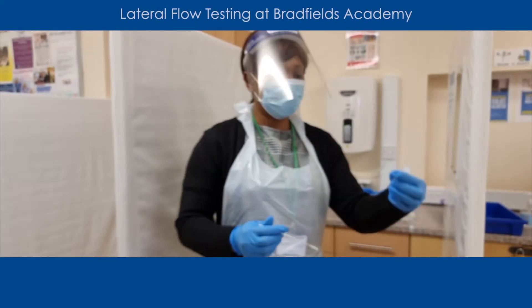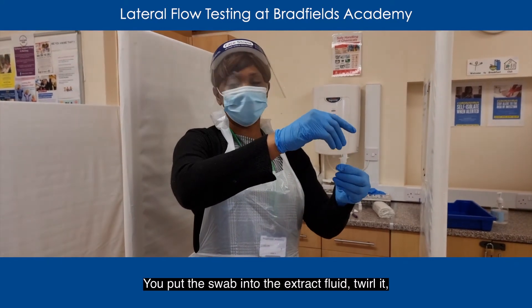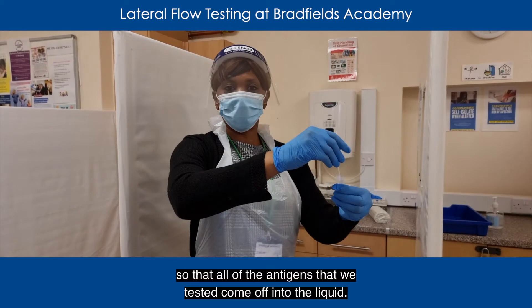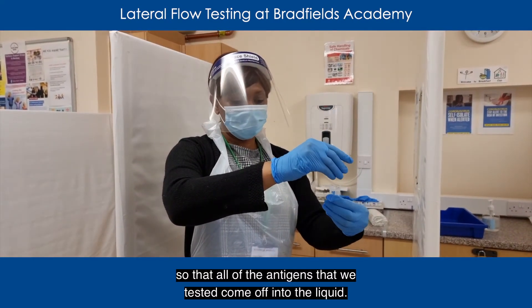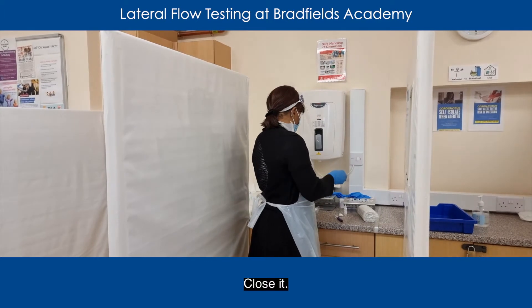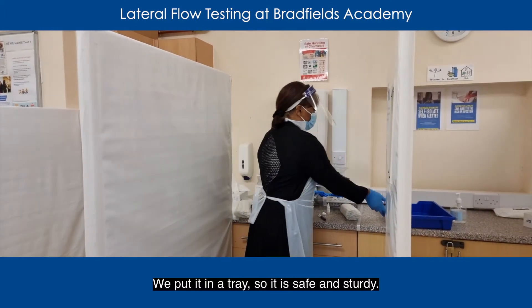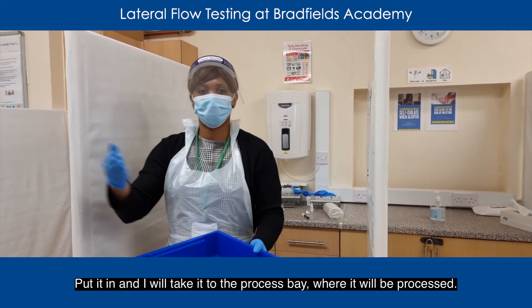So we've got what we call an extract fluid. We put the swab into the extract fluid and twirl it, so that all the antigen that we just tested comes off into the liquid. Put that away in the bin. Close it. Put it in a tray so it's safe and steady.